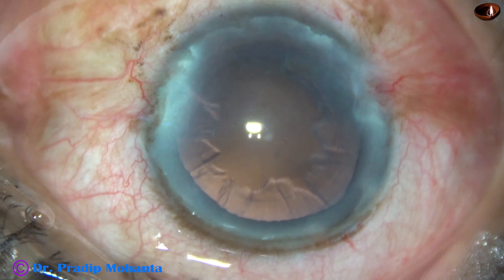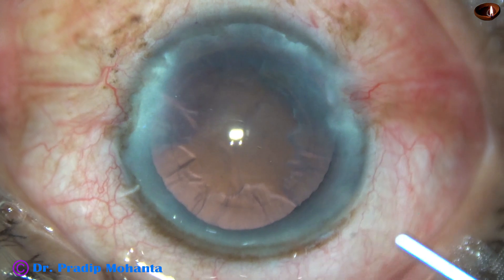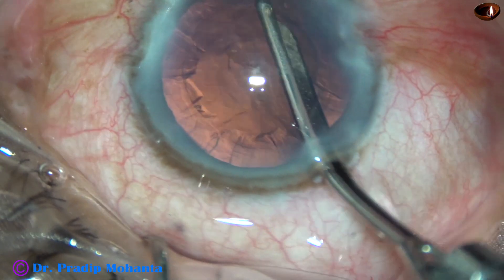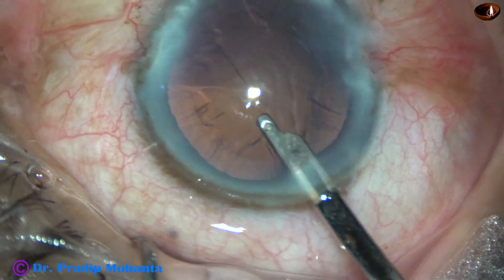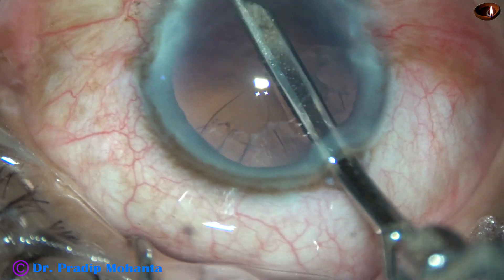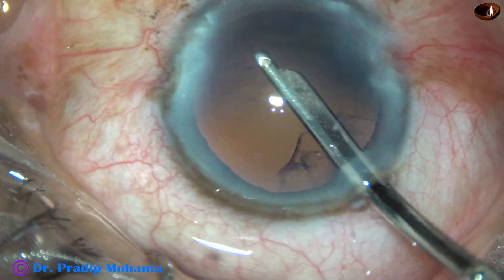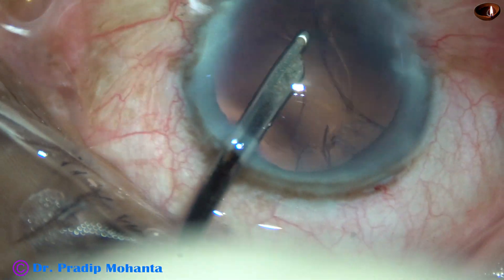Now the cortex is to be removed. Some viscoelastic is again applied. In this case I have made only one side port, so I am going to use a 23G Simcoe cannula for cortical aspiration. The cortex from all around is being removed — this is the cortex from 2 o'clock, this is cortex from 10 o'clock. Now the sub-incisional cortex can be removed easily going through the side port.